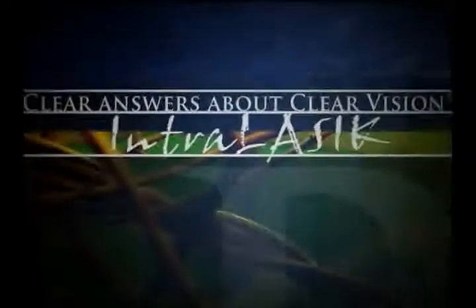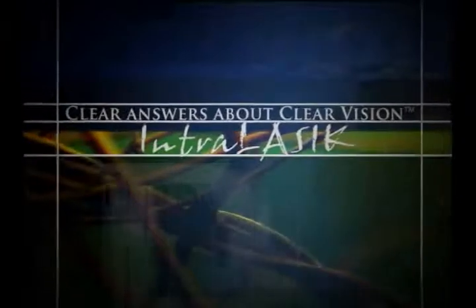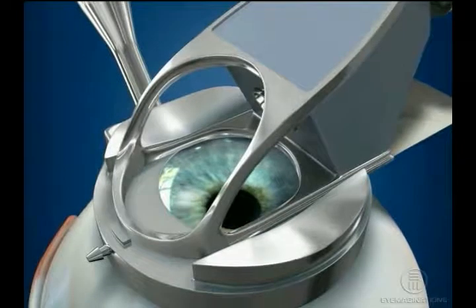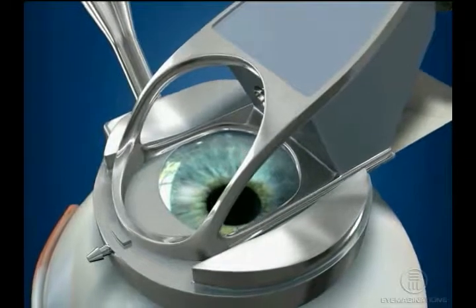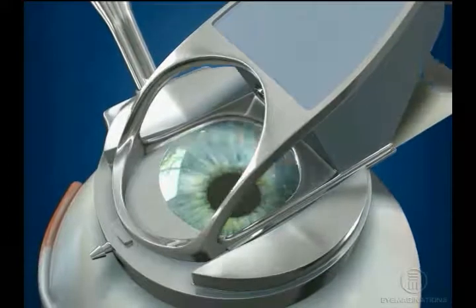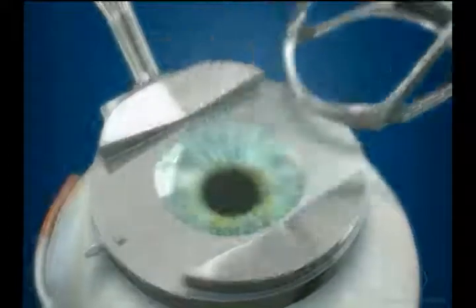One of the most significant aspects of LASIK is the first step, the creation of the flap. It used to be the most anxiety-provoking portion of the procedure for me and the patient because the flap was made with a metal blade with an instrument called a microkeratome. And we made a lot of people happy with microkeratome technology, but if there was going to be a problem, the majority happened with that step.